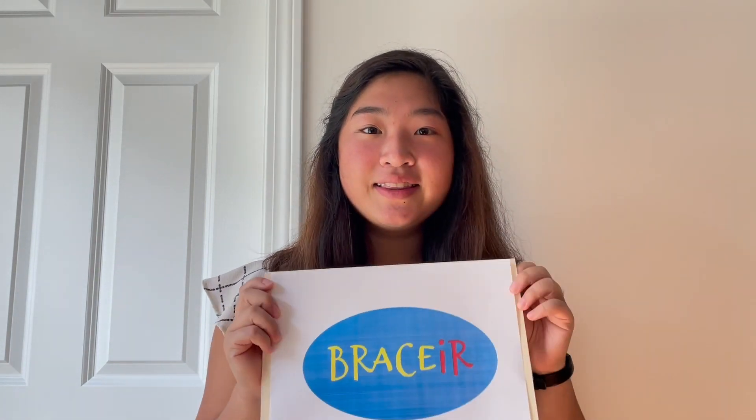We at SYC Orthopedics have been working tirelessly to craft a device that best suits your needs — one that puts the customer's interest first and helps you get your life back on track. We present to you: the Bracer. Let's take a look at some of our designs.